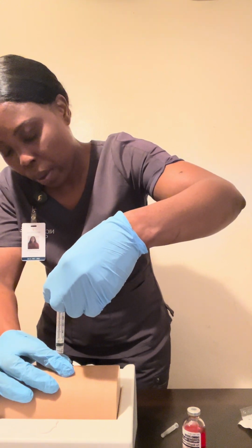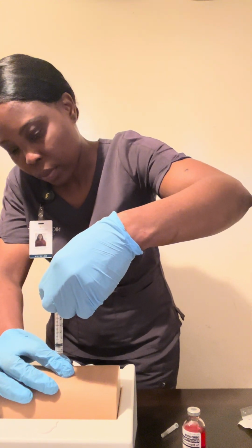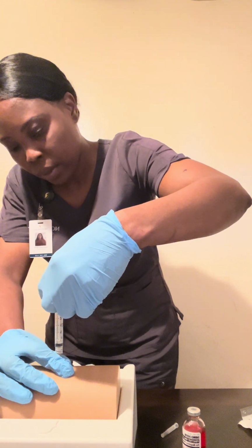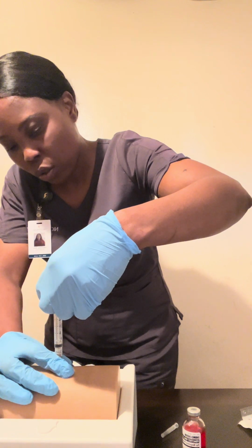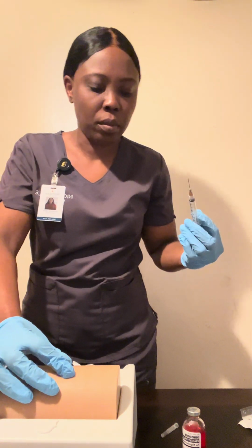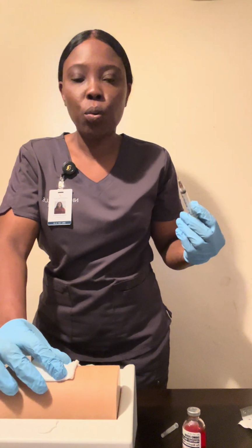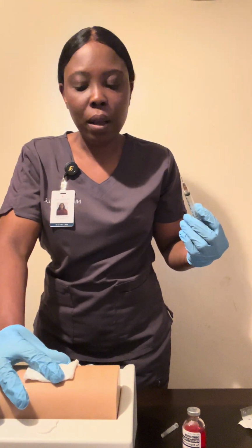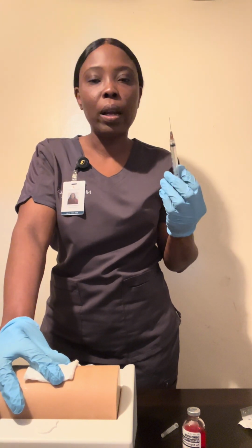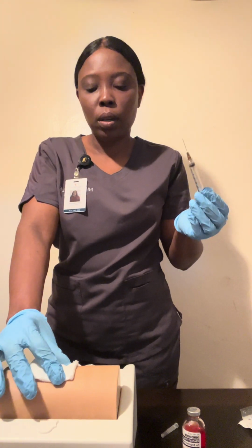I'm gonna make a little bit of traction, and then after that, before I remove the needle, I hold it for 10 seconds, and then now I'm gonna remove the needle slowly. And then I'm gonna put a gauze, apply a little bit of pressure, and I'm not gonna rub it. If the needle has a safety mechanism, I will initiate that safety mechanism, and then I'm gonna put the needle in the sharps container.